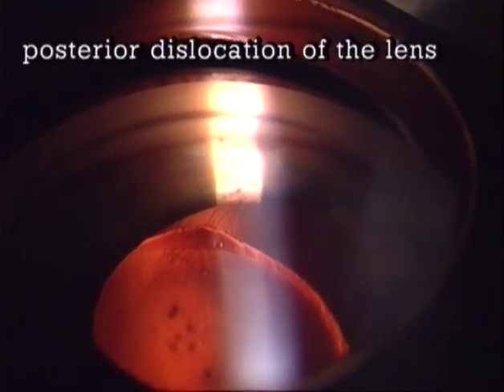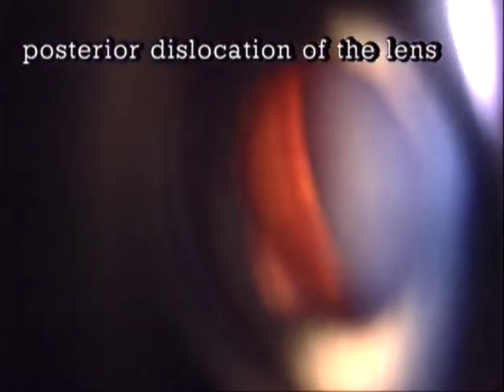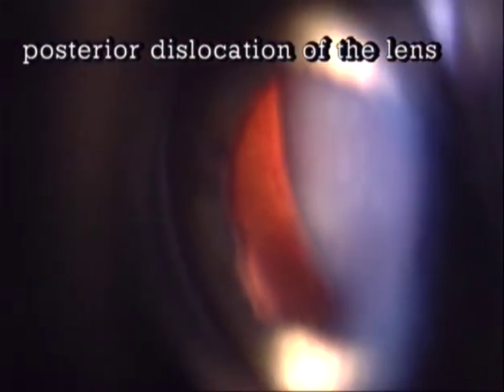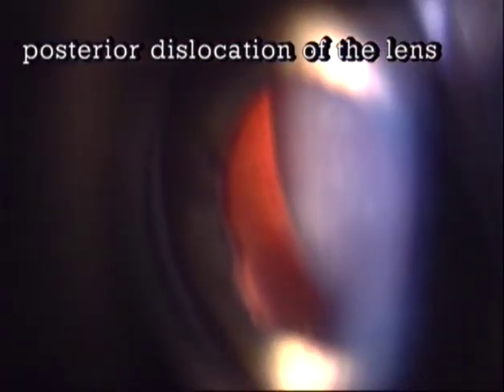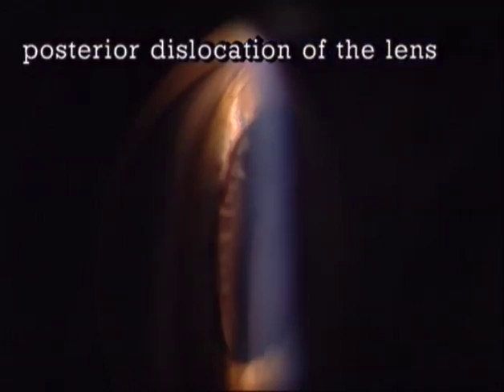Therefore, in this case of traumatic posterior dislocation of the lens, in the mirror of the contact glass, which is on the opposite side, the periphery can be seen with the peripheral retina and the retinal vessels, the ora serrata, and the ciliary processes.